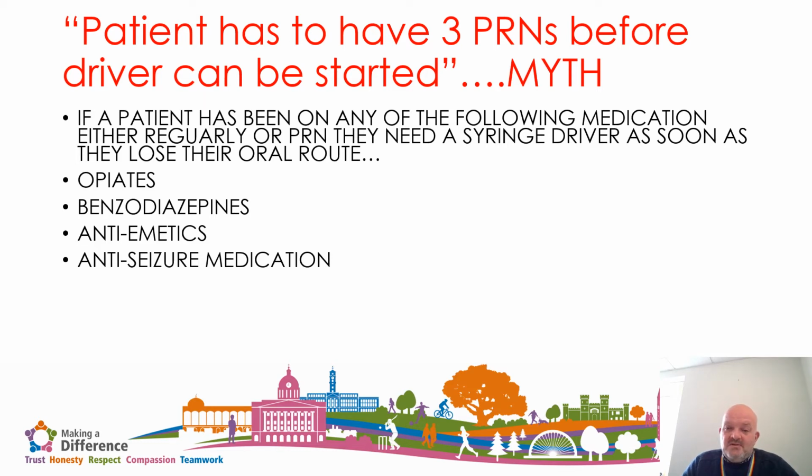And the reason that there shouldn't be a delay in the setting up of the syringe driver in this situation is that these medications are obviously there to control patients' symptoms. And if they are no longer able to take the medication orally, then we need to make sure that they continue to use that medication. So the way of doing this is to set up a syringe driver.